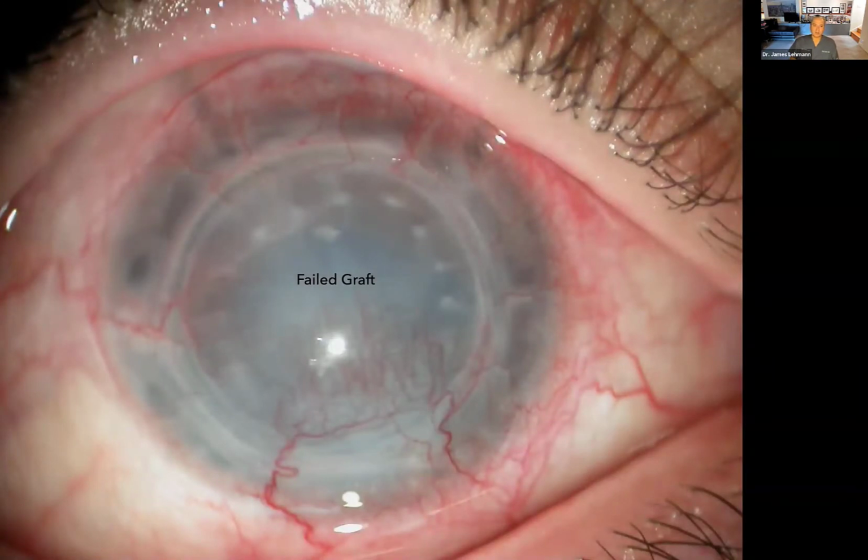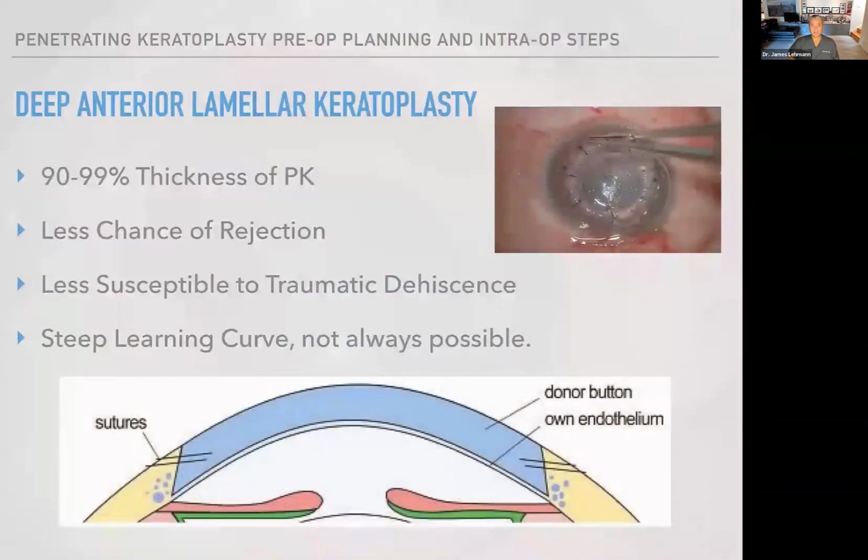So this is probably not the first transplant this patient has had. Now here, you can see, is there any viable corneal epithelium? Maybe not. No limbal stem cells. It may be conjunctivalized to the whole cornea. So in this situation, they're not going to do great with a repeat graft. So here it would be either a K-Pro or maybe a stem cell transplant from the other eye first.